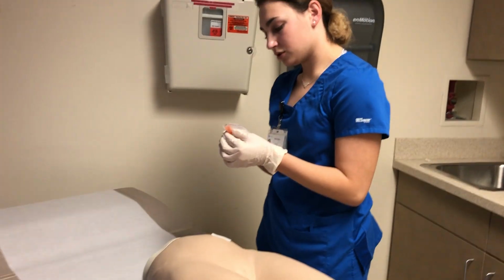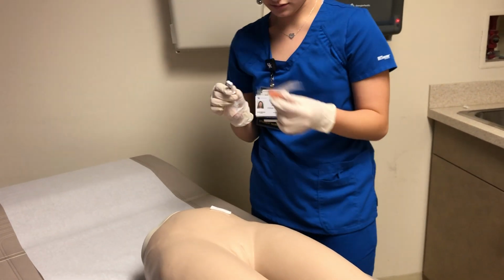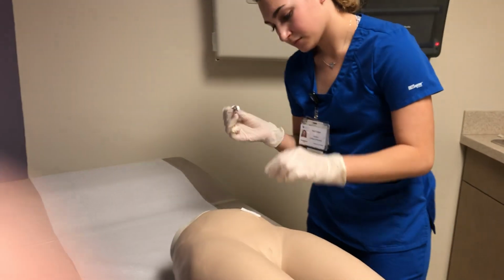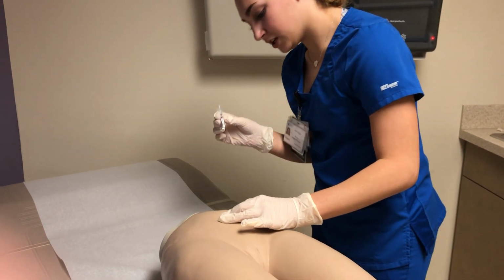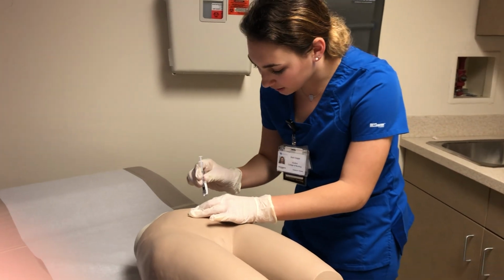I'm going to remove the cap. I'm going to remove the alcohol prep wipe. I can pinch up 2 inches of skin, so it is okay to give the injection at a 90-degree angle.